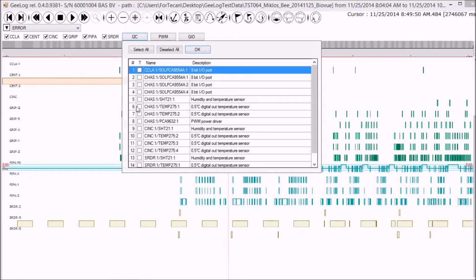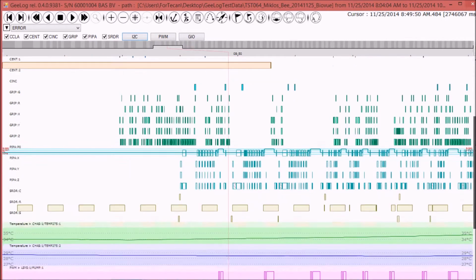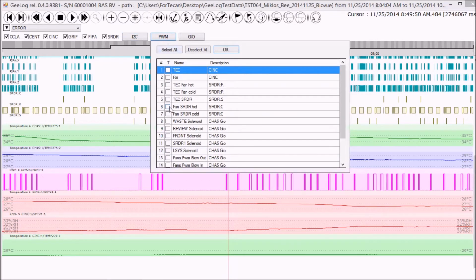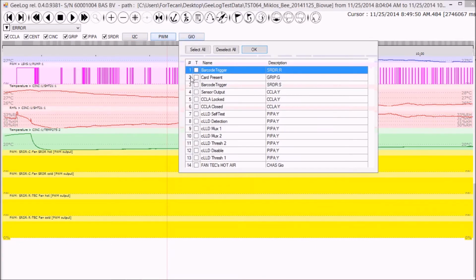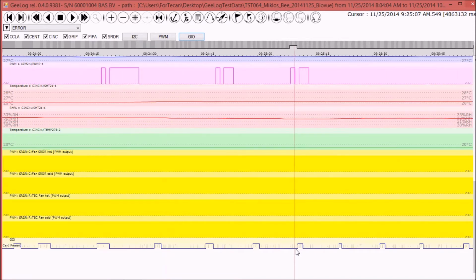For instance, we can show the temperature measured in different places, adding to the aforementioned stripe different stripes. For instance, these 2 lines, this in green and this in violet, represent the temperature in 2 different positions of the instrument itself. There are even digital data. In this case, this is the action of a pump. There are analog data as produced. For instance, we can show in the same timeline the drive of the motors. In this case, this is something which is not available in this stripe of data. There are other possible digital information that can be shown and analyzed by the operator.